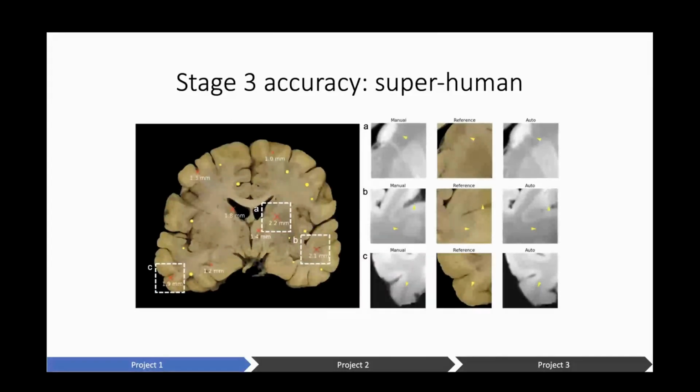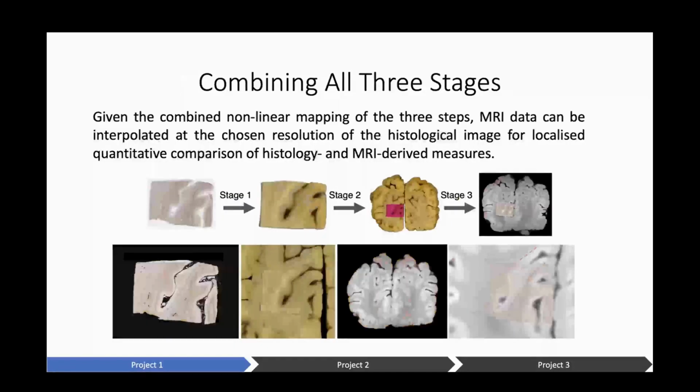So initially, we tried to quantify the accuracy of the algorithm by ourselves trying to create anatomical landmarks that are matching between these slice photographs and the MRI. So we were scrolling back and forth in MRI space. You try to find anatomically matching positions. And you realize that whenever you do so, you are this far away from the actual positions that the machine was able to find for you. So we were several millimeters off with our best guesses. So that was very convincing.